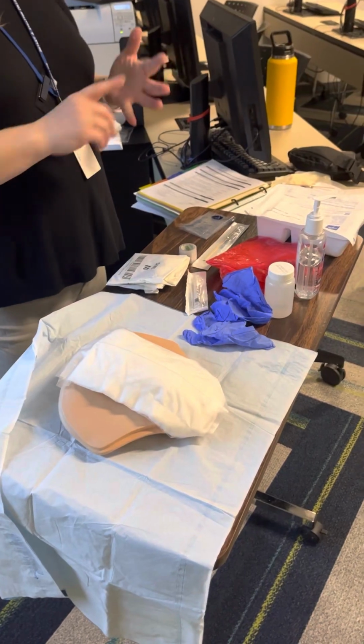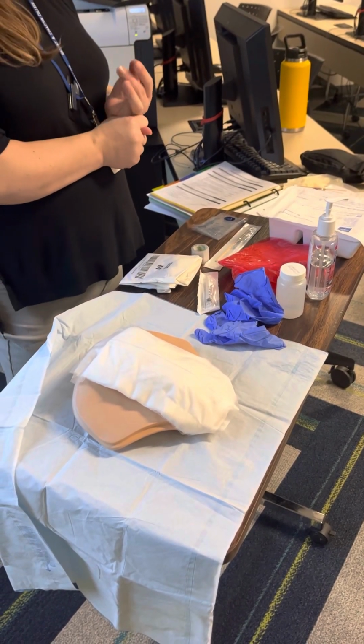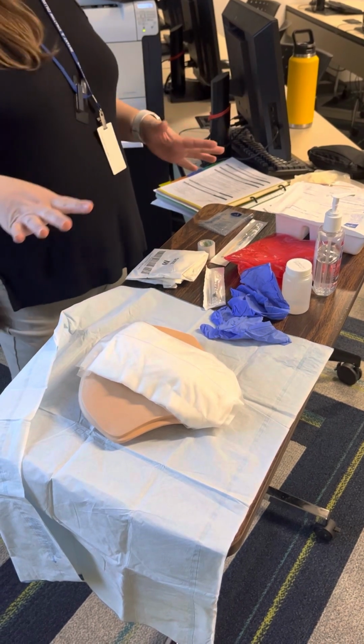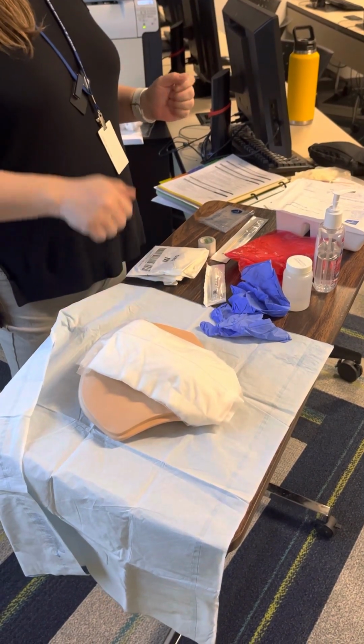So I'm going to check the medical record for size and location of the wound. I'm going to review the orders for the procedure. I'm going to gather all of my supplies. I am going to knock, introduce myself.